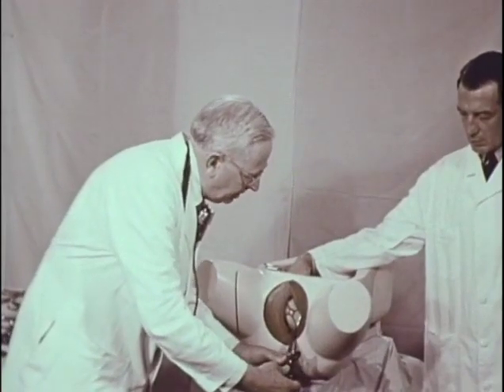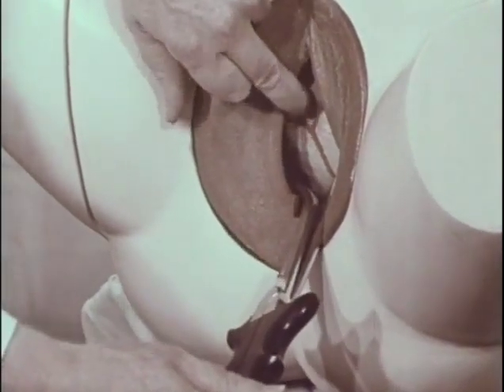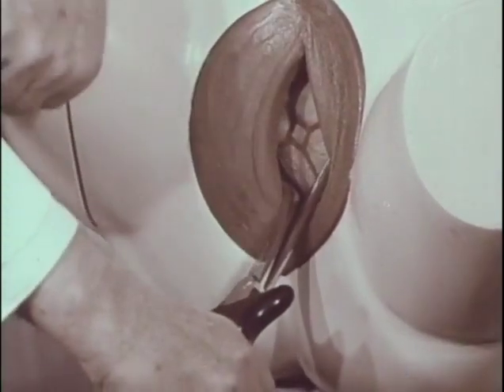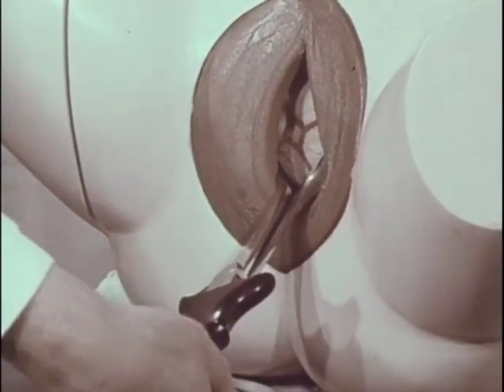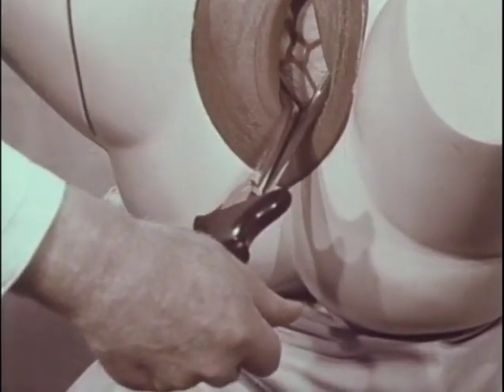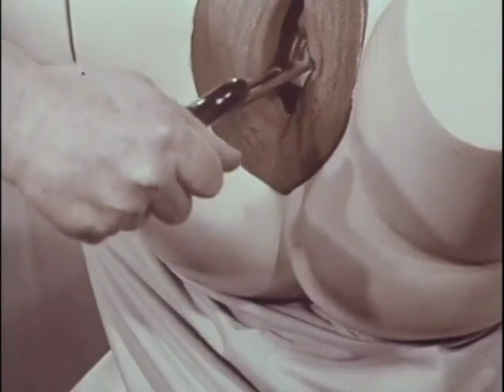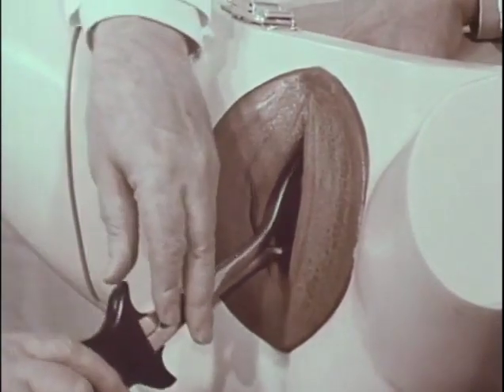Depress the handles well down against the perineum in order to have the shanks as close to the posterior fontanelle as possible. Check our application and proceed with rotation. The rotation is counterclockwise in left-sided position and is carried out by combining 4 maneuvers in one, and having them follow one after the other: compression, flexion, rotation over a wide arc with depression at the completion of the rotation.